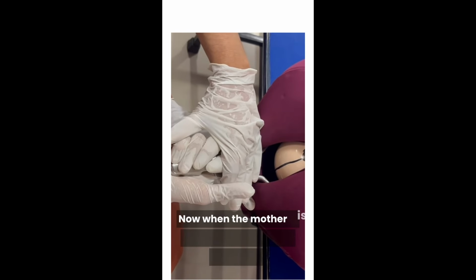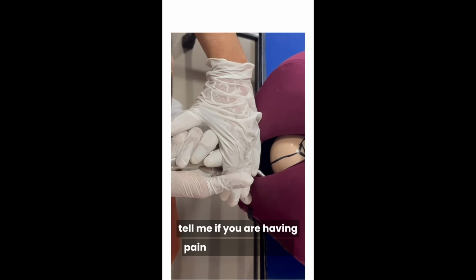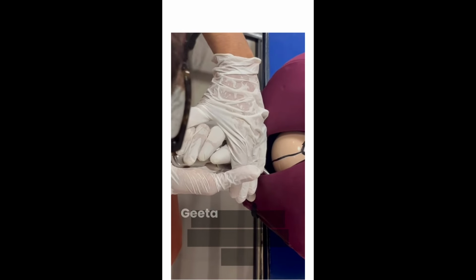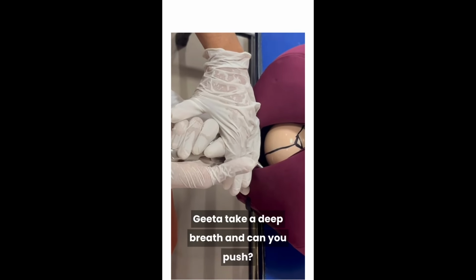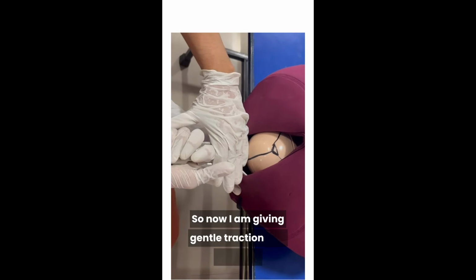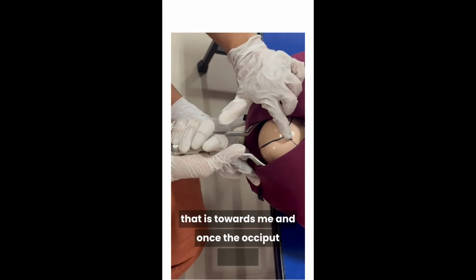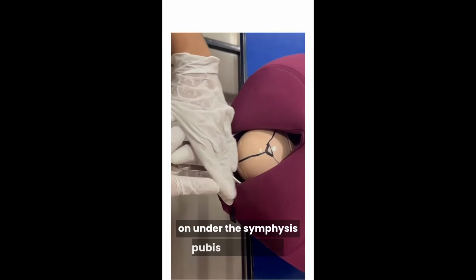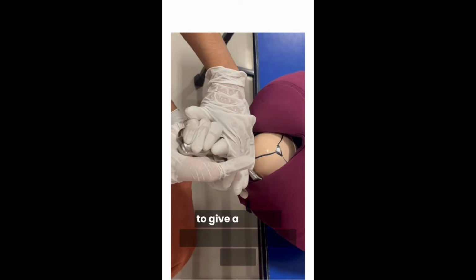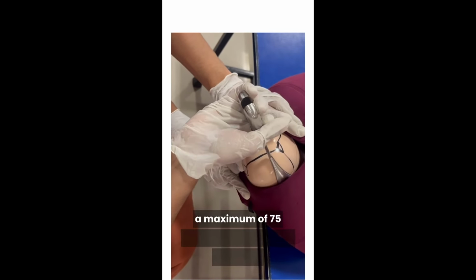Now, when the mother is experiencing pain, can you please tell me if you are having pain? Yes, Mrs. Geeta? It's paining. Okay, so she has a contraction. Can you push, Geeta? Take a deep breath and can you push? So now I am giving gentle traction first forwards, that is towards me, and once the occiput hitches under the symphysis pubis, I finish with the forward traction. Now I am going to give an upward traction to 45 degrees and to a maximum of 75 degrees.